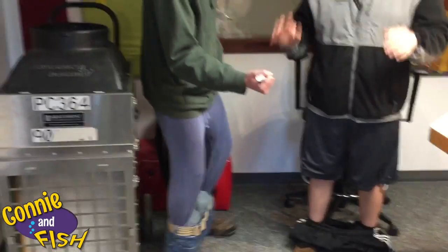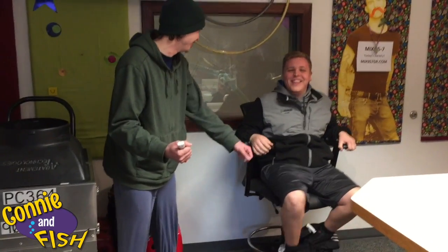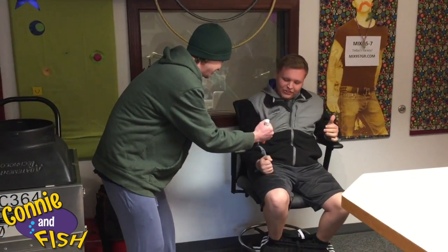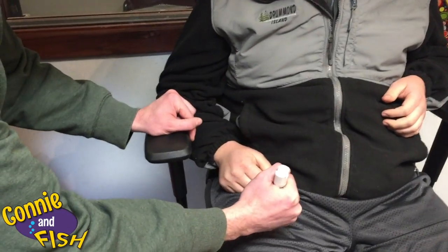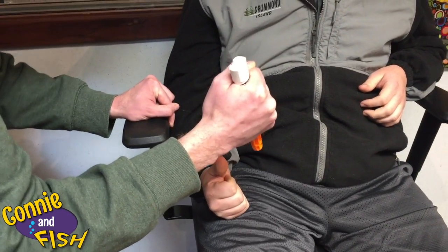Pants on the ground — yes, I'm wearing two pairs of pants, don't judge me, it's cold. If you see that they're starting to faint, try to put them in a chair and drop their shorts. And then you're going to slam it in. Hard but not super hard. Ready? Yep, I'm ready. When you slam it in, you're going to hold it for ten seconds.